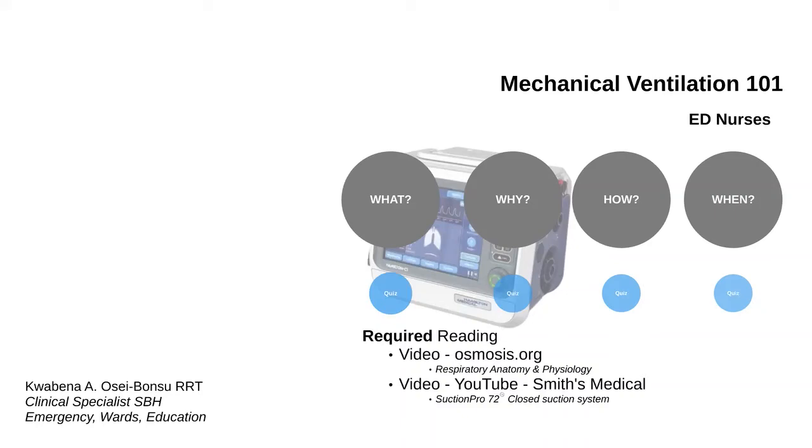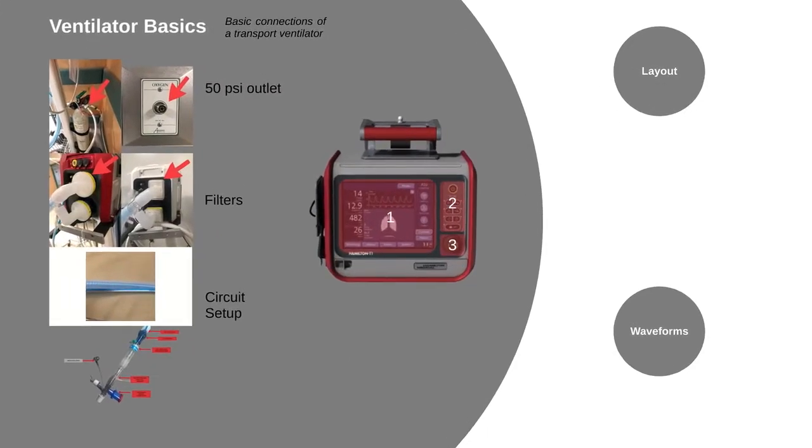Hello, everyone, and welcome to part two of Mechanical Ventilation 101. We're going to first start out with the how, which is how we ventilate. So, a few ventilator basics.